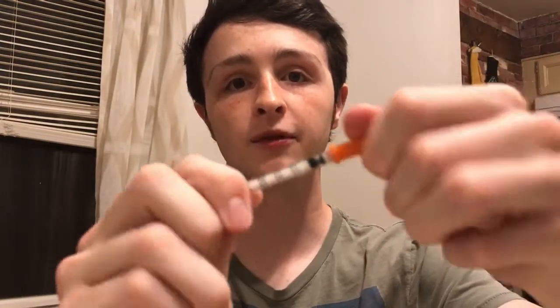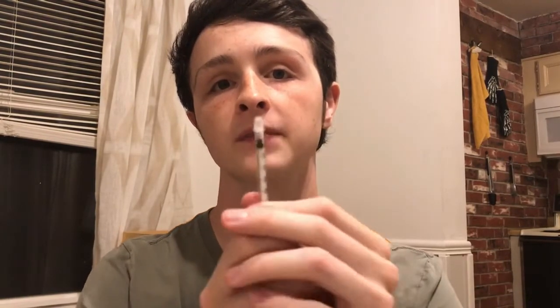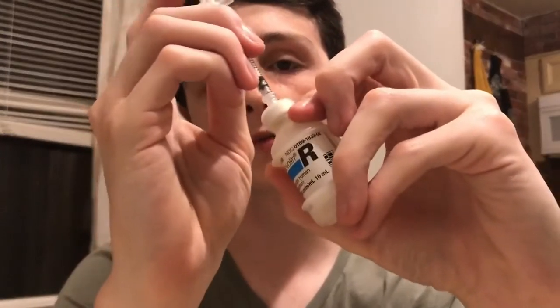First, you just take off the cap right here, and you take off the end right here, revealing the needle. As you can see, it goes up to 30 units. Let's say you want to do a 3-unit dose of insulin for the food you're eating. For a vial specifically, what you do is you first draw the syringe up to that 3-unit mark. Then what you want to do is plunge it into the vial, press that 3 units down, and then flip it over so that the vial is facing up and the syringe is going down.